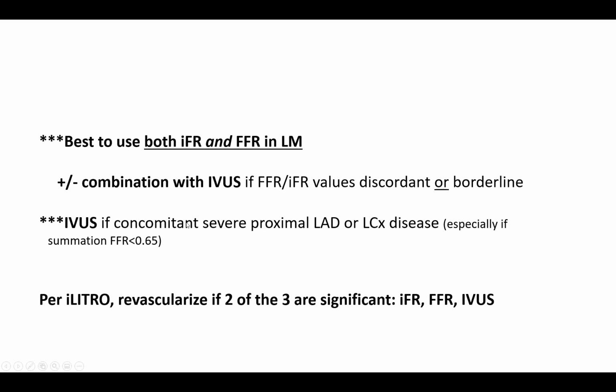And certainly if you have concomitant severe proximal LAD disease, especially if the summation FFR is less than 0.65. If the disease is more distal, or if the summation FFR is more than 0.65, I think you do very well by just measuring IFR and FFR.